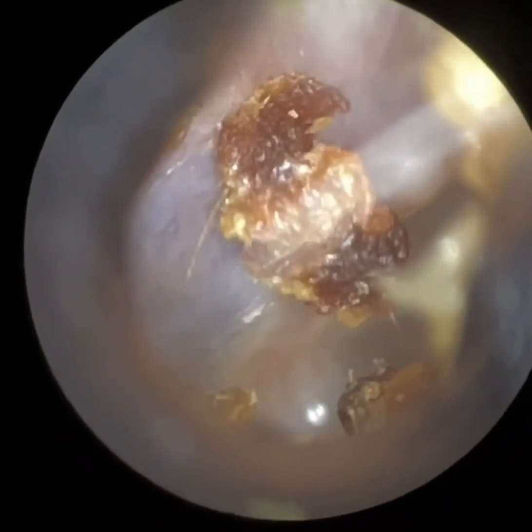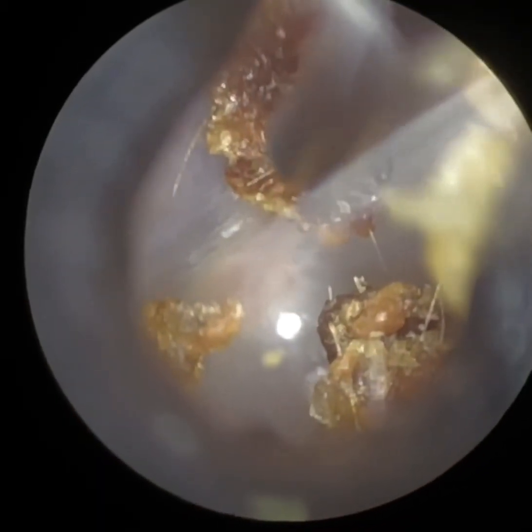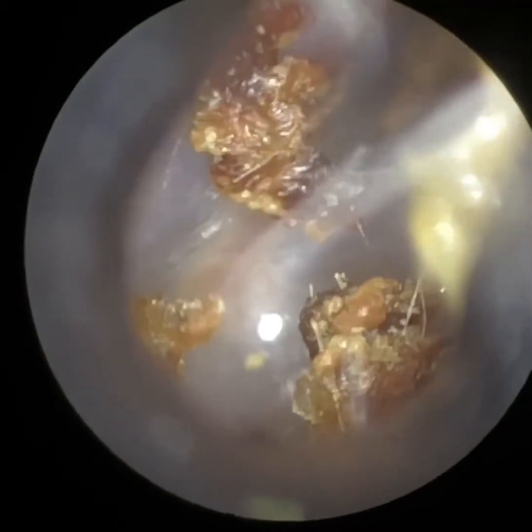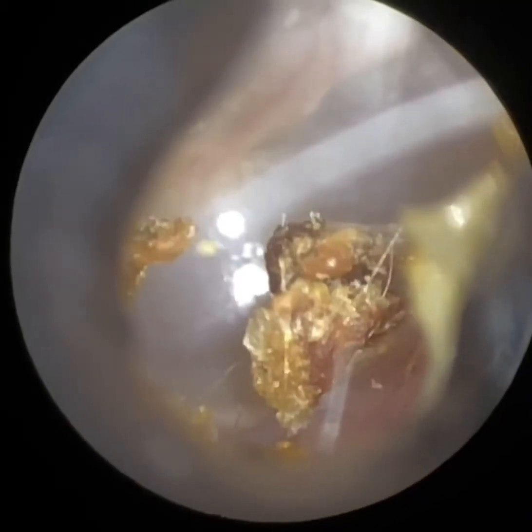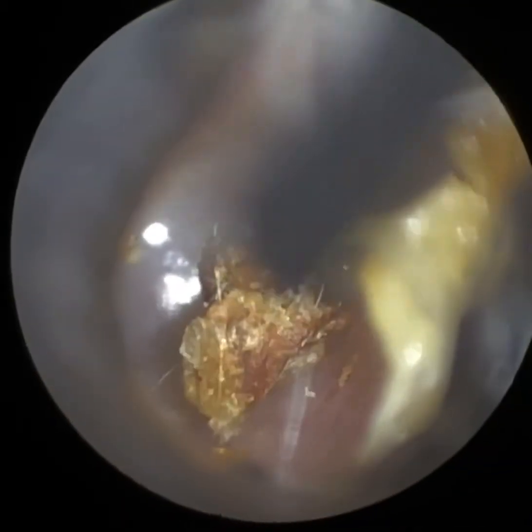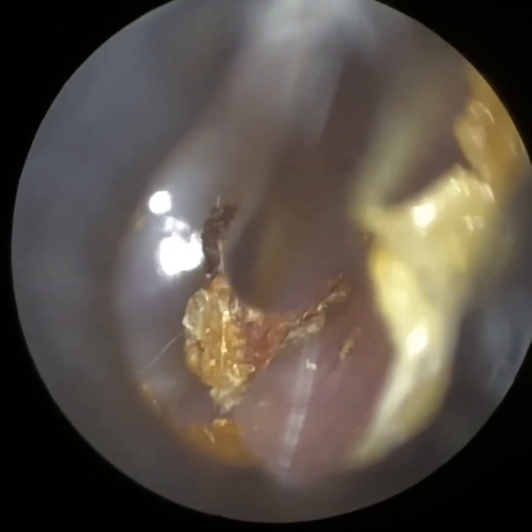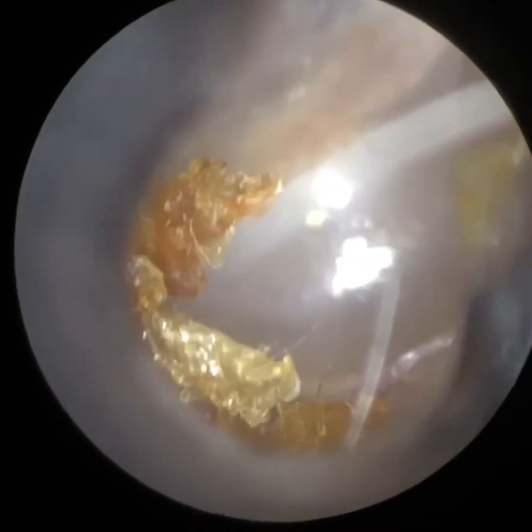So I'm going to go back in. There we are — we've got it in focus. And we're slowly going to just peel that away. You'll see all these little shards of skin were quite uncomfortable for the patient, and as soon as we removed it they felt a lot better — they didn't feel any itchiness in the ear. This is on the anterior canal wall, quite medial near the eardrum. I did spend a bit of time with the fine end just vacuuming this loose debris.